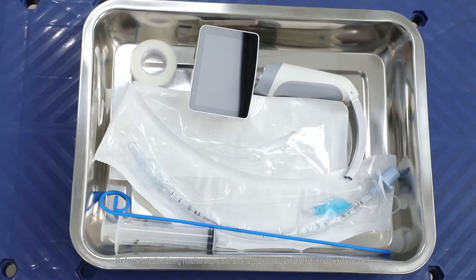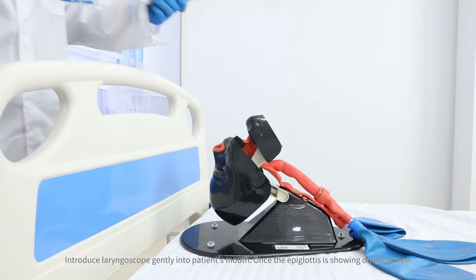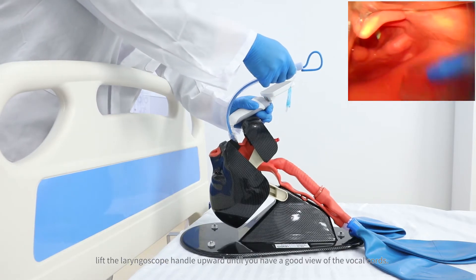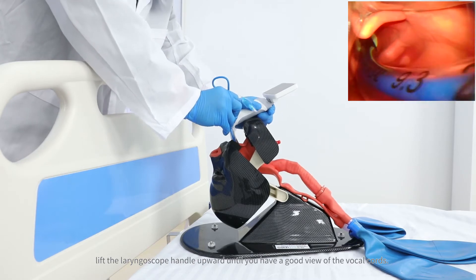Before intubation, make sure all equipment is properly prepared. Introduce the laryngoscope gently into the patient's mouth. Once the epiglottis is showing on the screen, lift the laryngoscope handle upward until you have a good view of the vocal cords.